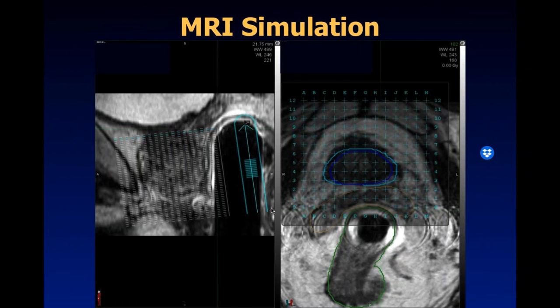And what we can do is we can take the probe, because these patients have their legs down during the MRI while their legs up during the implant. And what we did was we calculated using basic trigonometry what the angle would be for patients' apex down during MR imaging and then up when they're in the dorsal lithotomy position.